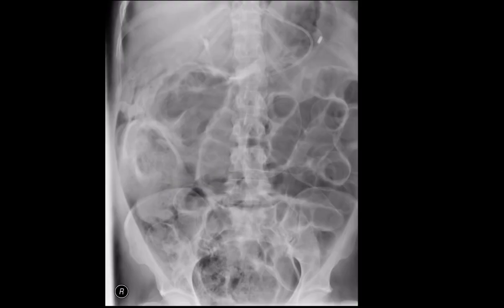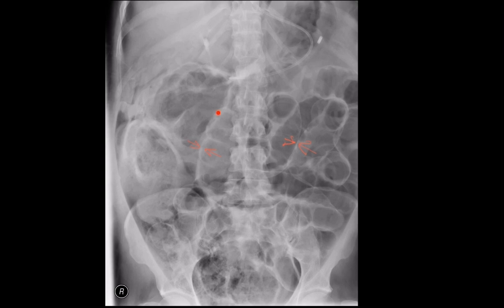This abdominal film gives us an example of Rigler's sign. There is gas separating the omentum and adjacent loops of bowel. You can see that both sides of the bowel wall are visible on this plain film. There is an interface between the gas in the lumen and the gas adjacent to the bowel wall. Note how the bowel wall also has a depth to it — this is not seen on a normal abdominal film.